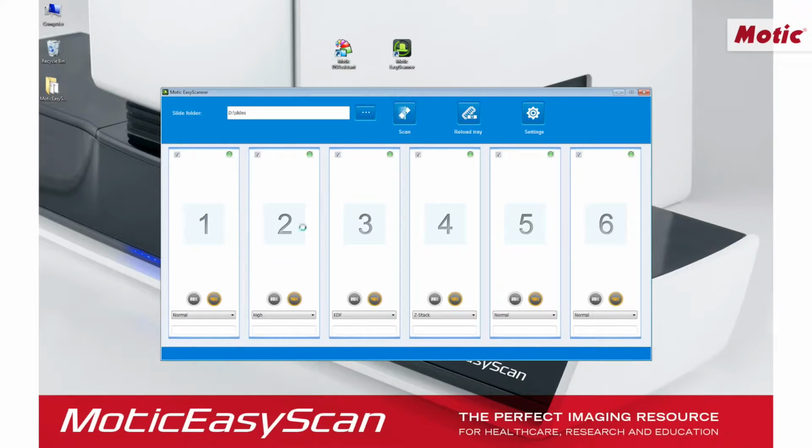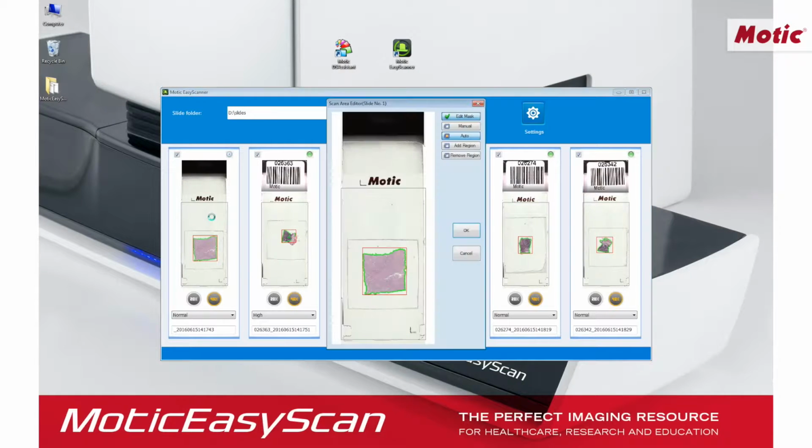Once we have decided the scanning condition for each slide, we can initiate the process just by pressing Scan. The scanning area is automatically selected, which means that the area within the slide containing the tissue is detected and bordered.